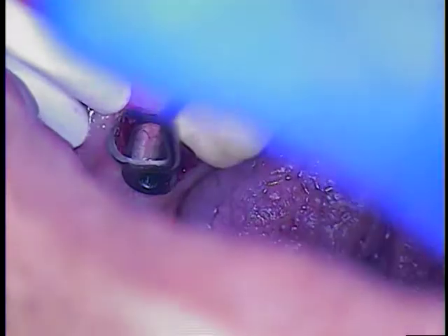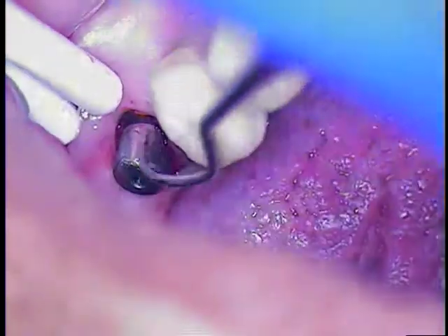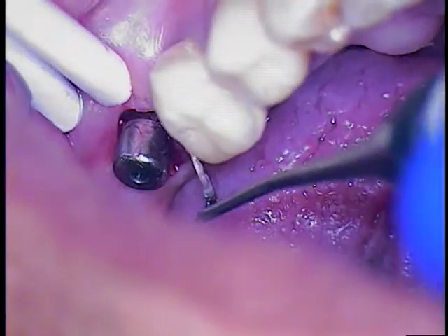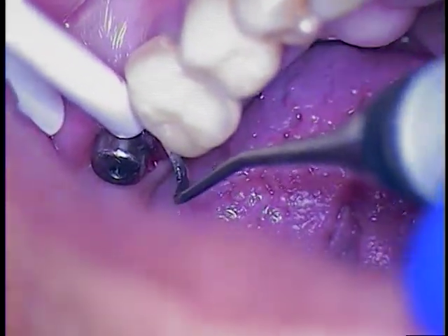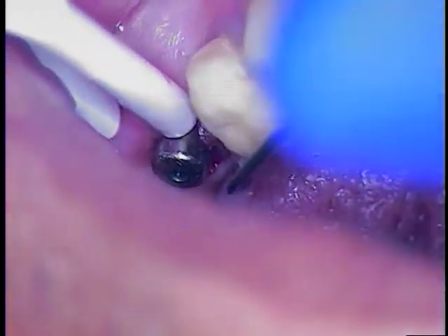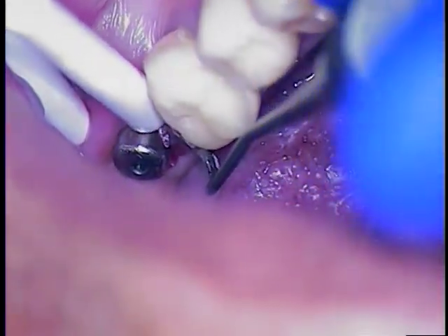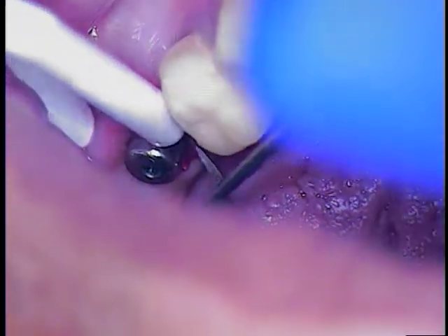Right on the angle of the ramus — there's hardly any connective tissue back there, it's all mucosal, hardly any bleeding, which is good. Now this anterior region — get rid of that tissue.